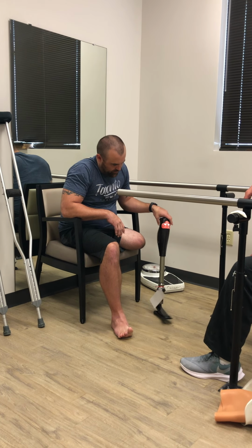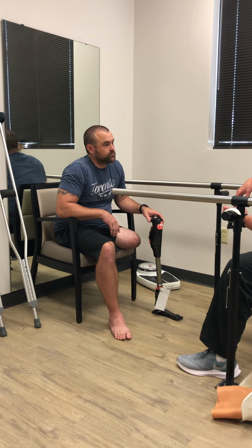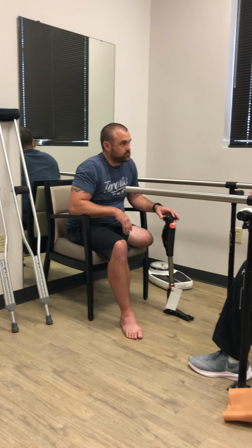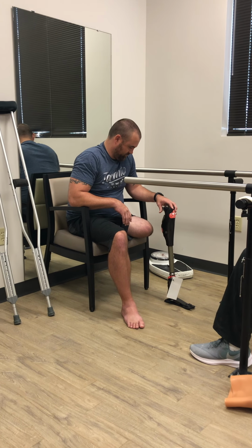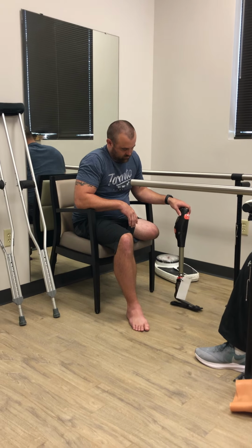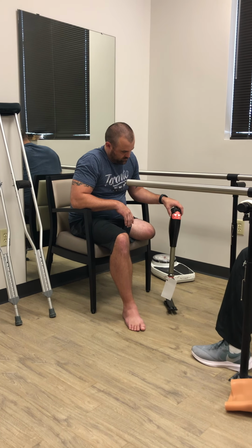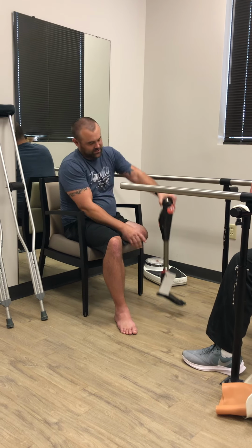Some of these pylons are a little tricky. This one goes anterior, some of them go posterior. The old ones used to go posterior, so guys who have been around a long time still get messed up, because they've changed the back versus the front so many times that you wonder which way this pylon goes. If you don't have it on right, then depending on the knee, it won't register. The knee won't be able to read what the foot is doing, so it completely throws the knee off. But that's it, it's pretty sweet.